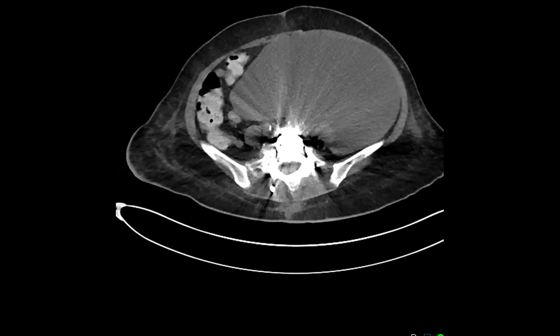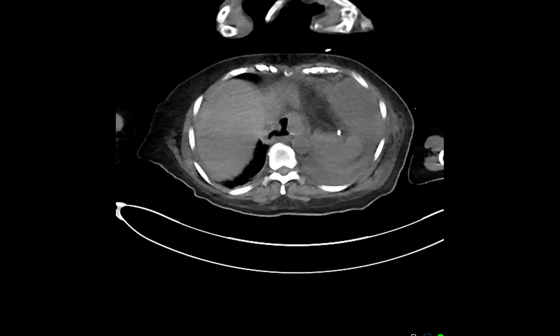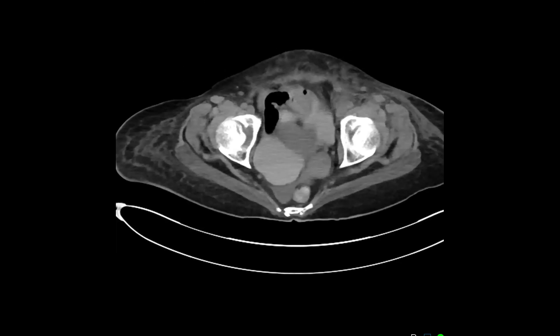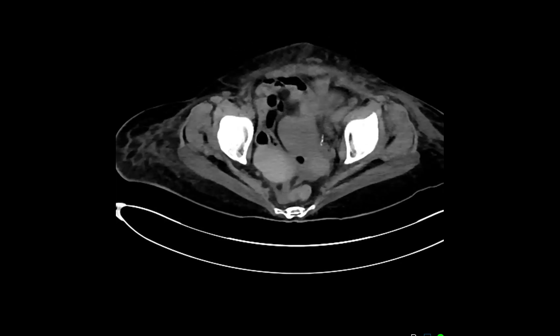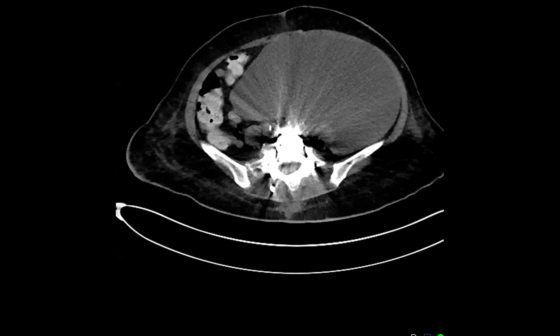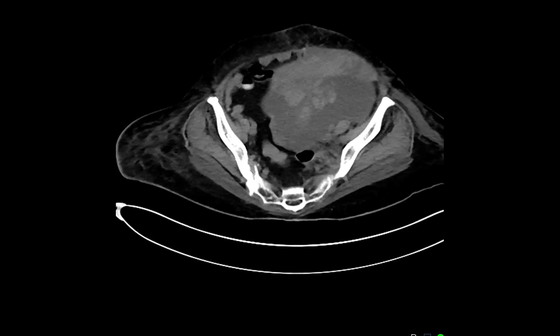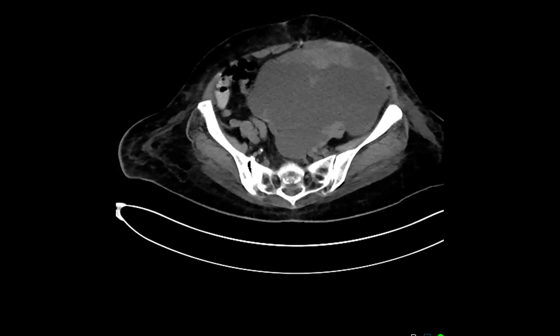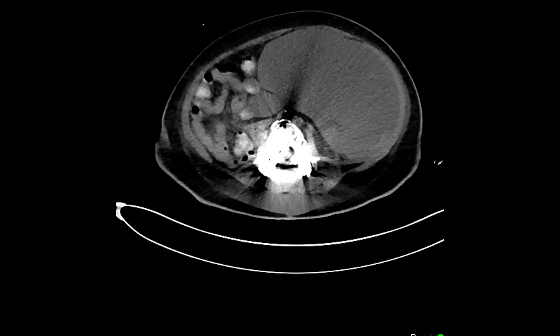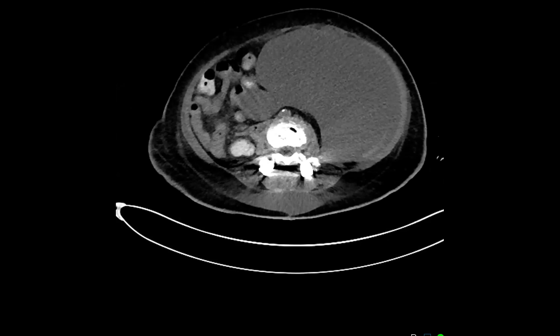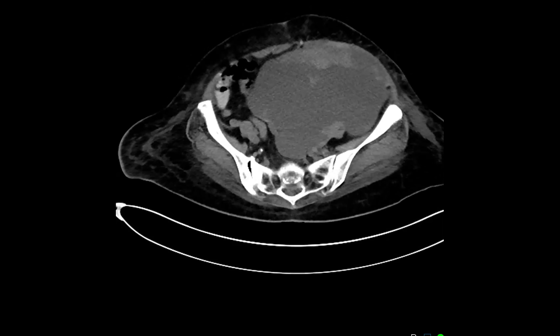Is it simple or complex? It looks complex — it has soft tissue nodularity, although on non-contrast we can't tell the difference between blood products and soft tissue. I would want post-contrast or MRI. When thinking about retroperitoneal lesions, I think about sarcomas, leiomyosarcomas of vessels, solitary fibrous tumors, mucinous neoplasms with malignant degeneration, and nerve tumors like cystic schwannoma or lymphangioma.